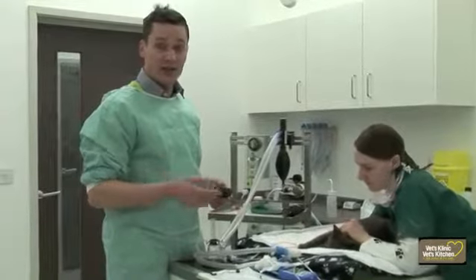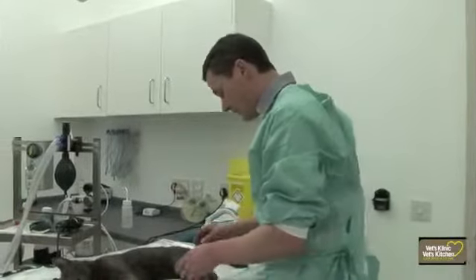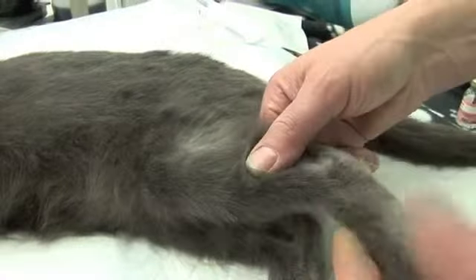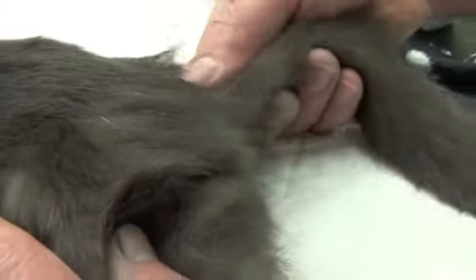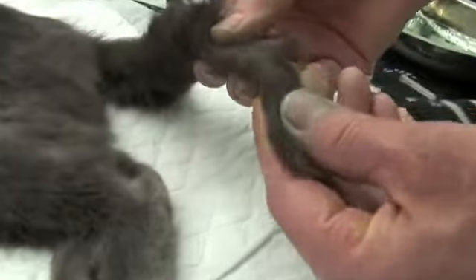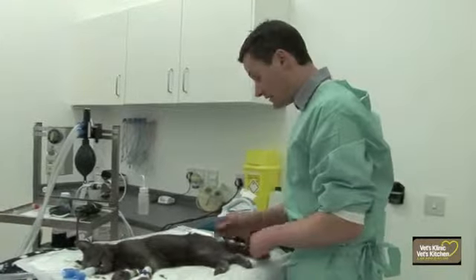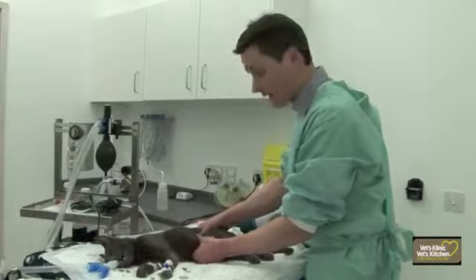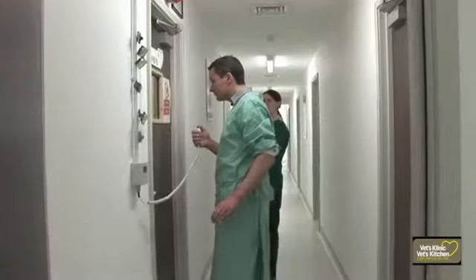We're just going to anaesthetise him, and then the first thing we're going to do is take an X-ray and see if we can assess the extent of the damage to his tail and check for other injuries, particularly with his pelvis and that area. So Tommy's asleep now, and we can have a better examination of him, and he's lost some fur on that leg and down there. His nails look okay, but there's a big swelling at the base of his tail, which feels like quite a serious fracture or dislocation, which is why it's gone so floppy. And at the end of his tail, that's all kind of fused together, which might be an old injury, or is possibly somehow connected to this as well. But I can't feel any other injuries of his pelvis, which is encouraging, because that would make his injuries a lot more serious. But as it is, I think the likely outcome is he's going to end up being a cat with no tail.